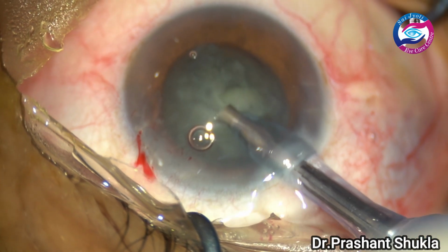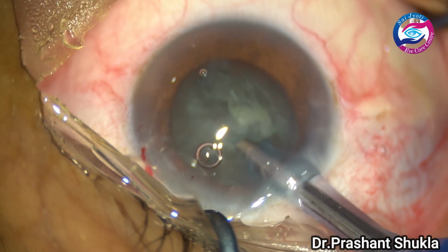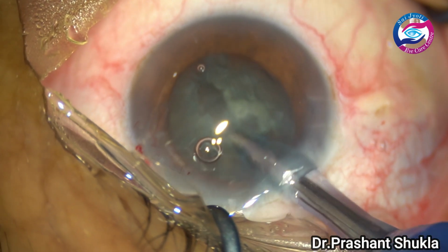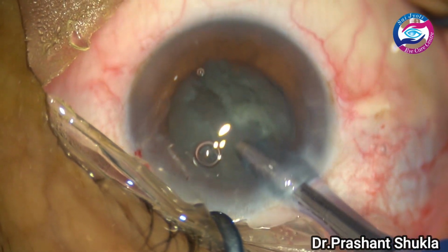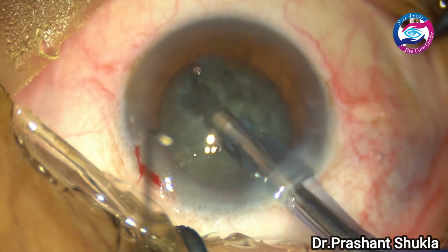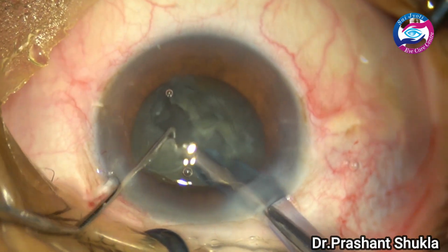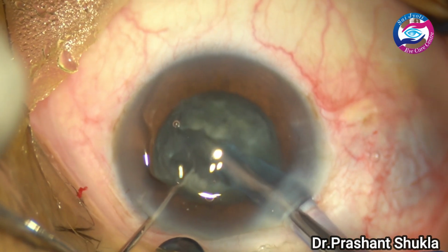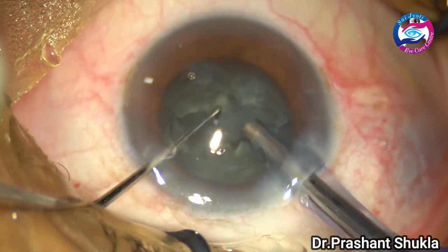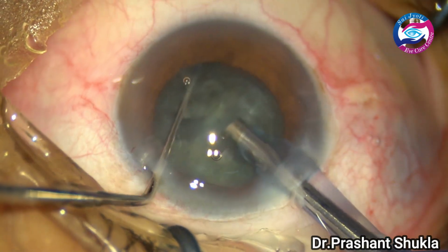So I am now taking the phaco handpiece and making a trench in the center. I am going to make a long thin trench and try to divide the nucleus using the trench and divide technique. After sufficient depth is reached, I am using 2 instruments and trying to separate 2 heminuclei. Now is the time to do the chopping.